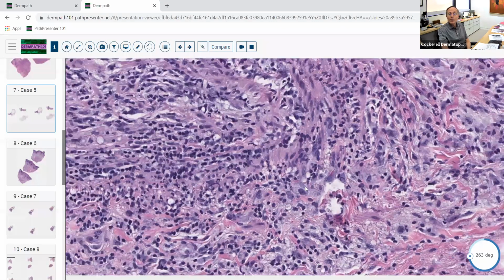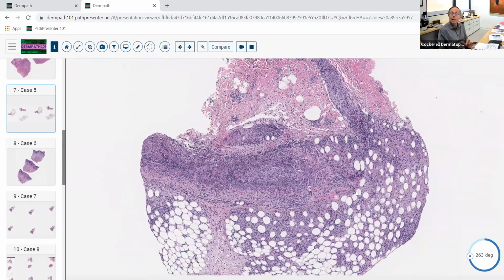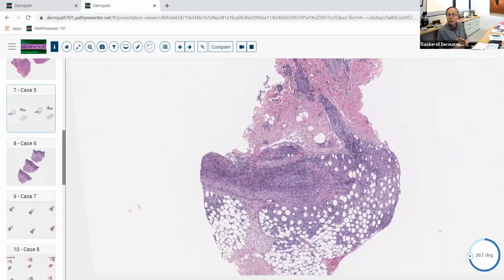And we see suppurative granulomatous dermatitis, and here we've got even suppurative granulomatous dermatitis and panniculitis. The most common pattern of that is due to rupture of folliculitis or rupture of a cyst. So by far the most common suppurative granulomatous pattern in the skin, even though it's a foreign body reaction, is ruptured folliculitis. The second most common is probably some type of infectious process.